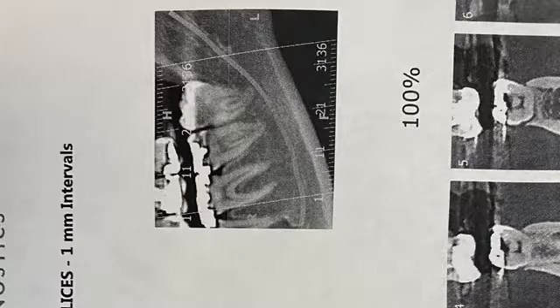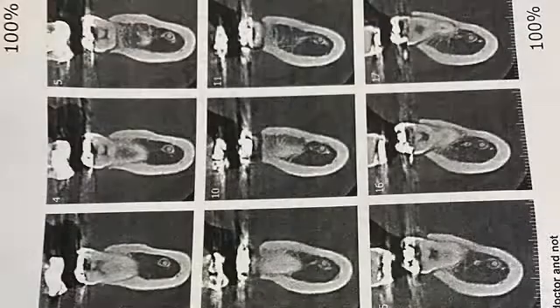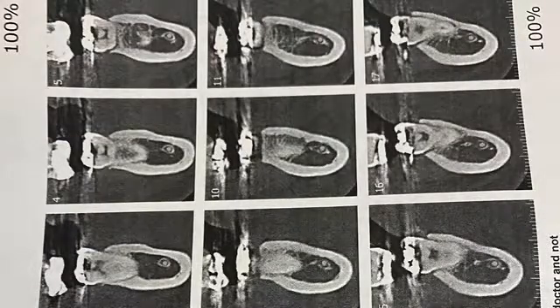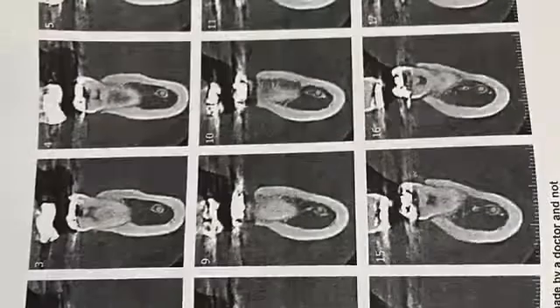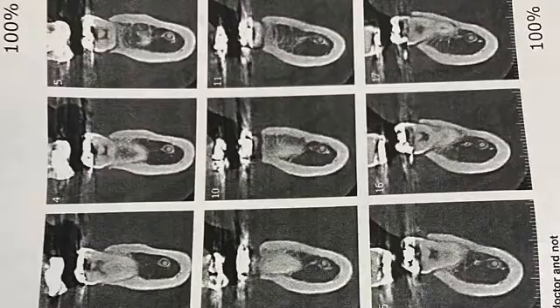I had to obtain a CT scan. Looking at the CT scan, the inferior alveolar nerve is very close. The CT scan also shows the outer angle where the IA nerve is actually more buccal compared to the root of the tooth.